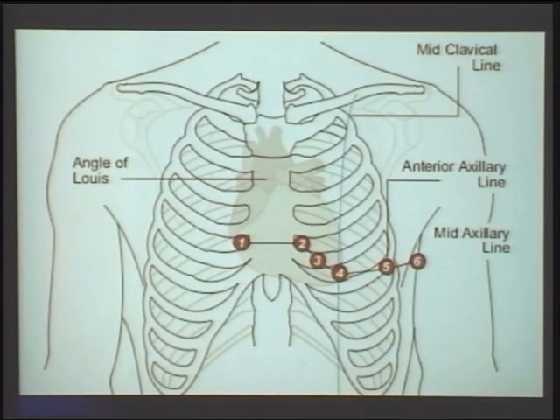V5, V6 is my anterolateral wall. So it is placed on the sides. So I am looking at the anterolateral wall. So chest leads have given me an idea about the right ventricle, interventricular septum, anterior wall and anterolateral wall. Through L2, AVF and L3, I saw the inferior surface. L1 and AVL have given me the high lateral surface. So I have looked at all the surfaces now: high lateral surface, anterolateral surface, anterior surface, right ventricle and inferior surface.